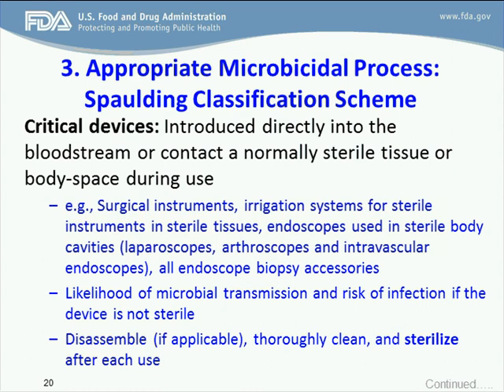Microbial transmission from critical devices and the risk of infection if the device is not sterile are likely. These devices should be disassembled if possible and thoroughly cleaned and sterilized after each use.